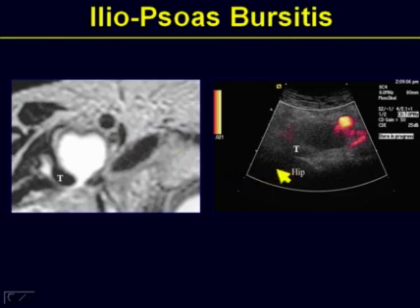So on ultrasound on a short axis view now, one more time, bony acoustic landmark of the femoral head. On top of that is the tendon of the iliopsoas, and put Doppler in because immediately you confirm that what was signal void on MR and initially anechoic now clearly were the great vessels. But what's important about this case now is you can appreciate the fact that we have clearly demarcated all the structures. Therefore, we can now thread a needle exactly to the area that we need to sample.